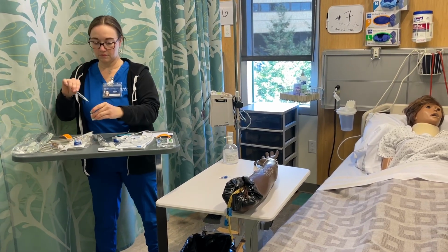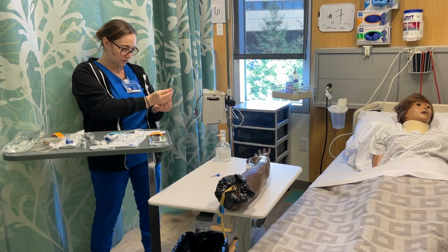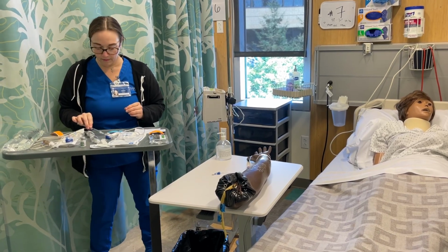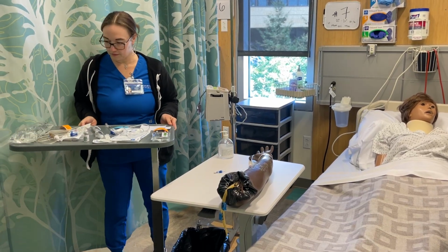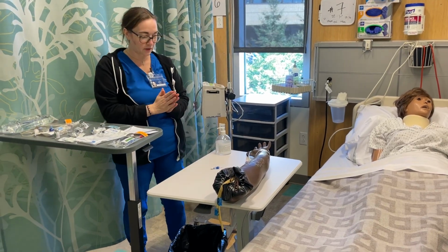And then making sure that the patient is okay. I'm not seeing any reactions from her arm or demeanor. And I will make sure the patient is okay for a little bit. Okay, we have that. So now I'm going to inspect the IV site.